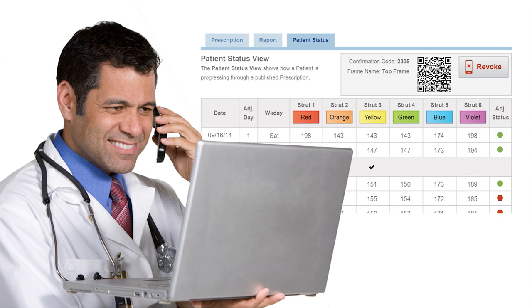Based on the possibility that your patient is choosing not to make adjustments due to pain or some other compounding factor, it is recommended that you check in on patients chronically displaying the skipped and overdue statuses.